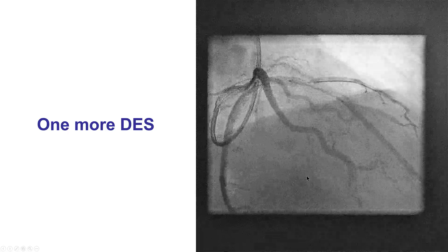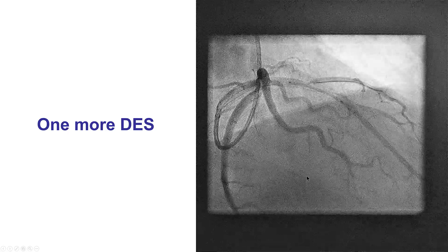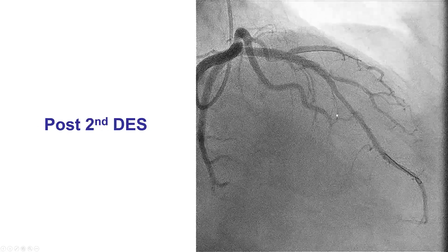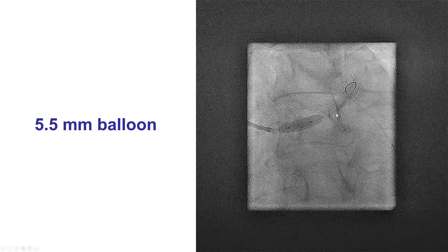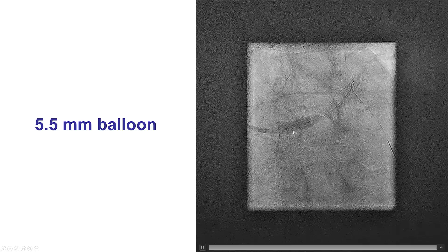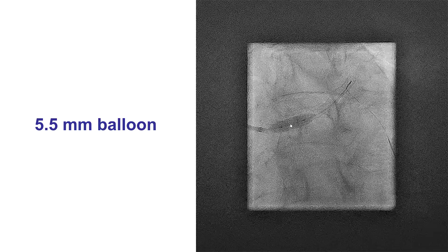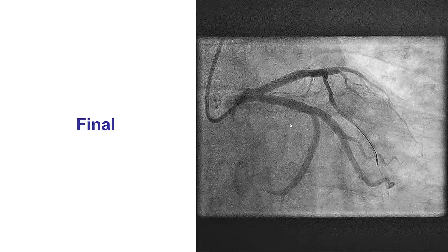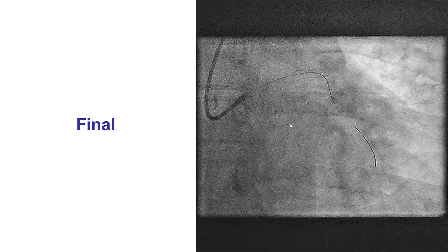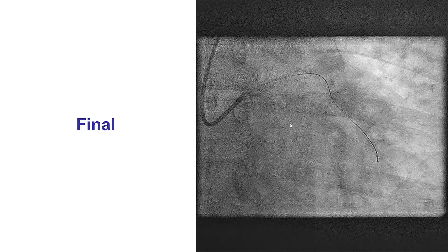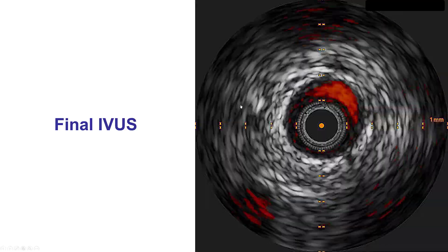Instead, we placed another stent to cover the uncovered part of the lesion in the proximal to mid-LAD, which provided a nice result. We then did post-dilatation of the left main using a 5.5 mm balloon. This exceeds the supposedly upper limit of expansion of the Xience stents, but we felt we had no choice. After doing that, we had a nice result geographically with TIMI flow into the LAD as well as the circumflex and the left main.